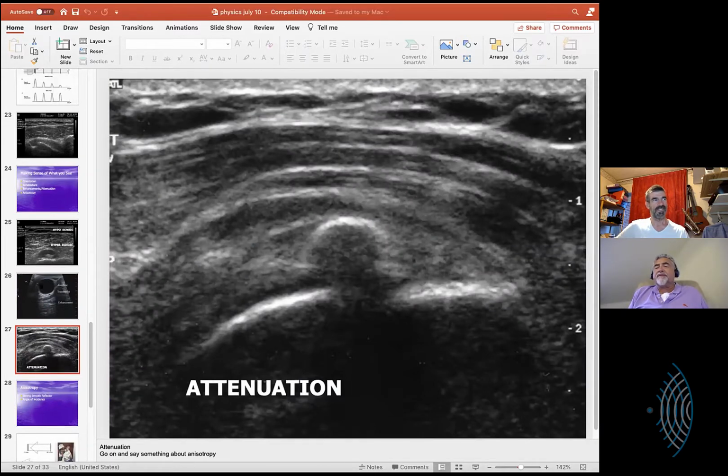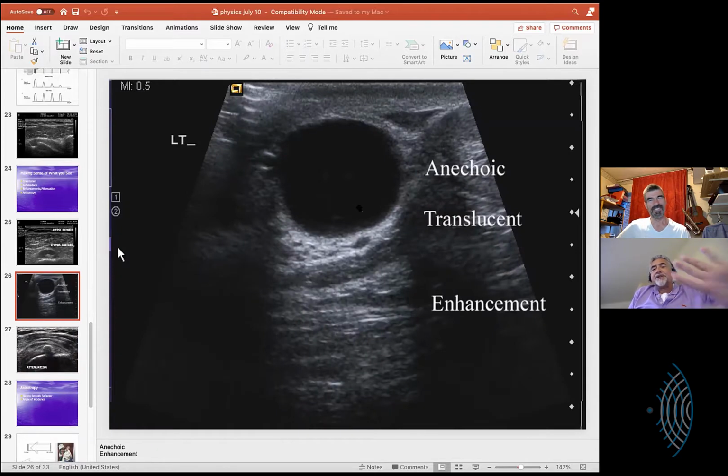I want to go back through this stuff again, but I want to ask you this final thing, and then just stop it right there. We talked previously about the lateral dimension being a function of the probe type, that the axial dimension is a function of frequency, and that the elevation dimension is really a function of the quality of the probe, and they're getting that narrower and narrower. Were my assumptions correct on what I just said? Yeah.